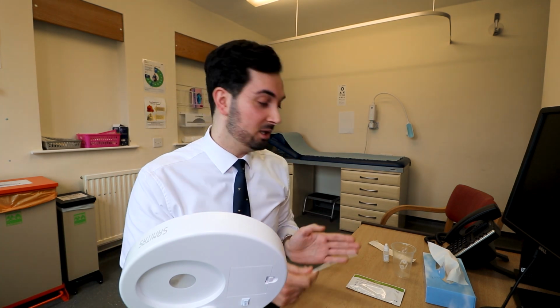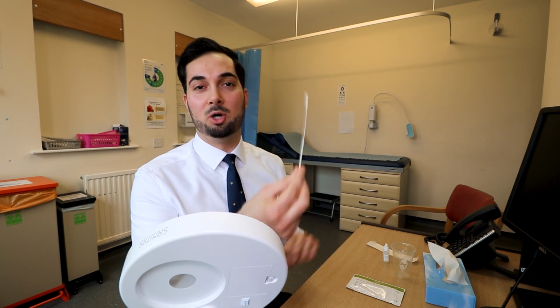If your kit is like my kit, like the IBD one, which I showed you earlier, it only requires you to do a nostril swab. So it doesn't require the throat swab, and you do 2 nostril swabs. Now the way you do it is the same depending on whichever kit you've got. It's the exact same thing that you're going to do. So you're going to get your disposable swab, you're going to hold it upright, you've got your fabric end there.